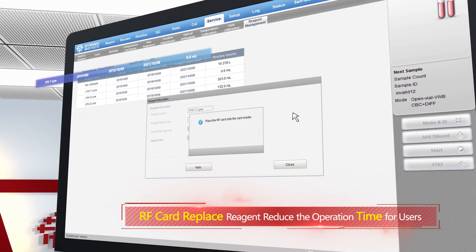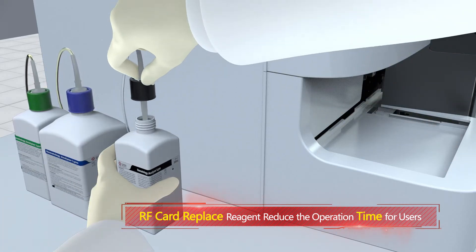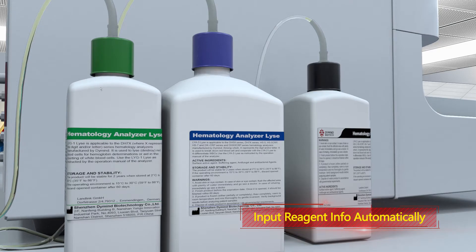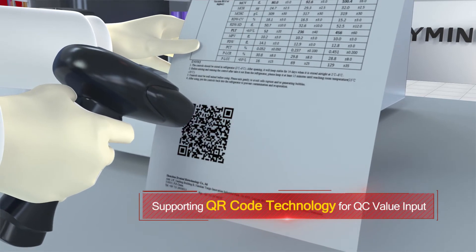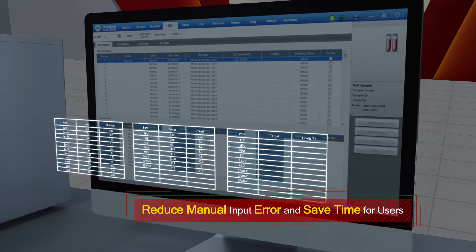RF card technology replaces manual reagent management — waving the RF card inputs all reagent info directly into the software. An intelligent QC system allows all QC info to be inputted to the software automatically after scanning the QR code on the QC sheet.